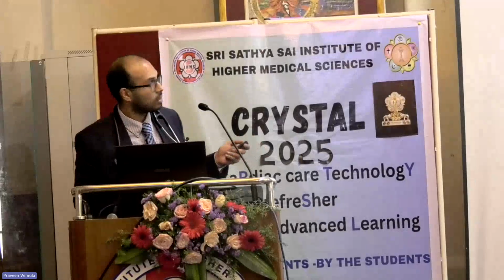I'm Dr. Silar. I'll be talking on Cathlab materials, basic Cathlab materials. So all our interventions are done through sheaths, right? So one French is equal to 0.33 mm.